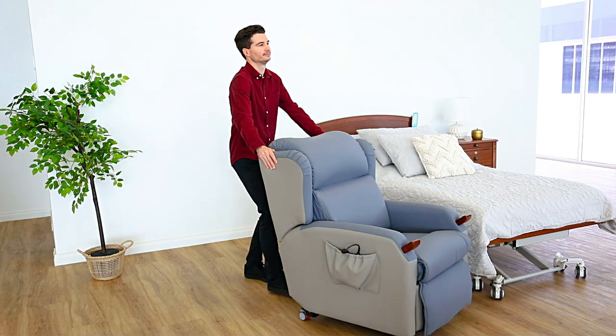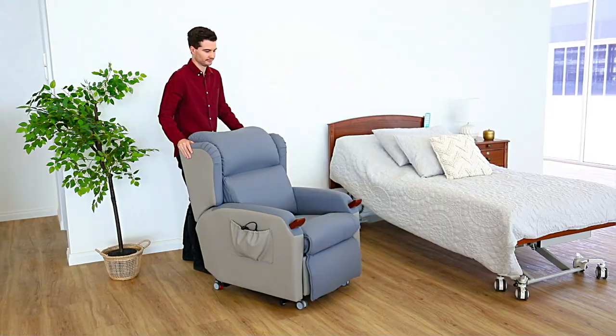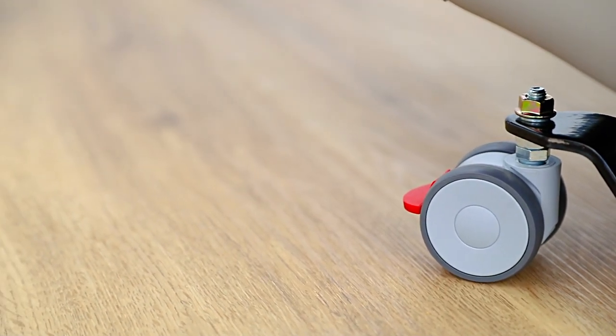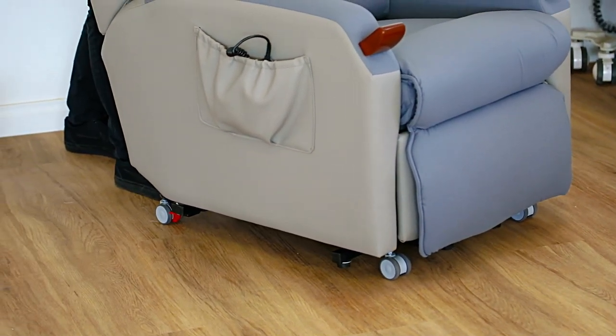Moving the chair is effortless with sturdy casters located at the base. The rear lockable casters provide additional stability if required, and a swivel function on the front casters offers easy maneuverability.